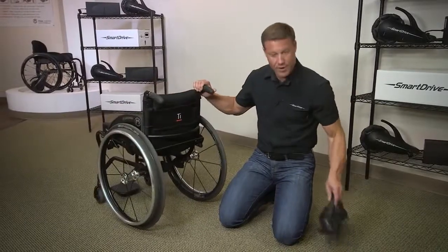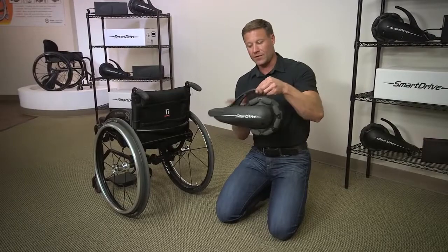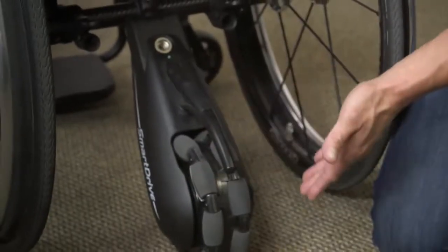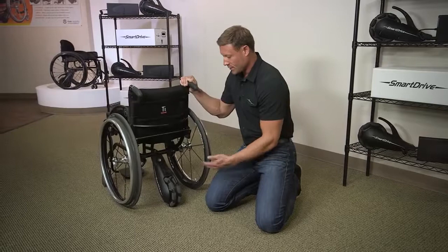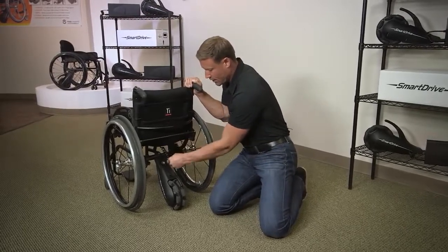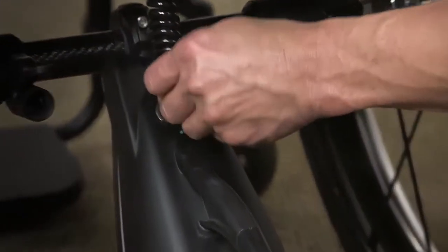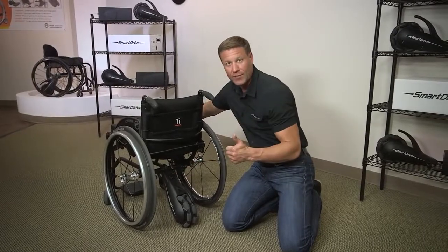spin the chair around, grab your drive unit. Usually you lift from the rear of the handle. That makes the drive unit look level. You then line it up and drop it on the hitch and rotate it into place. It's now securely there. The SmartDrive is not an anti-tip, so it allows your chair to rotate, do wheelies. You reach up, you grab the plug, you find the white arrows and line them up towards the front of the drive, align it, push down. Once you've plugged it in, you get a green light that says you're ready to go.